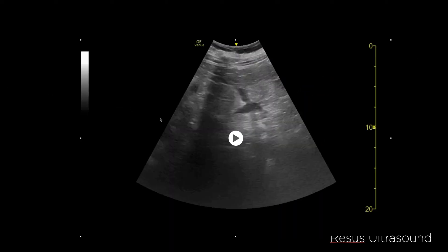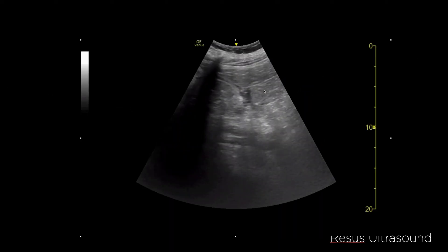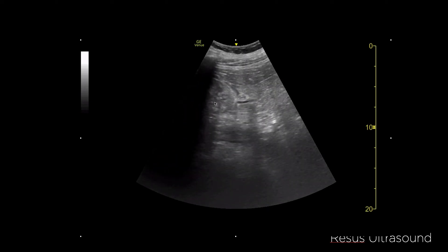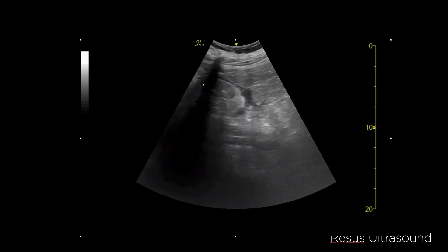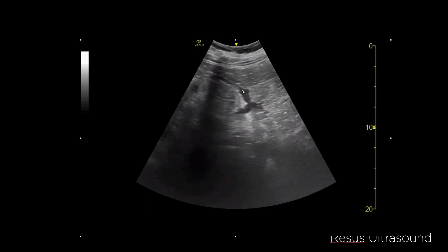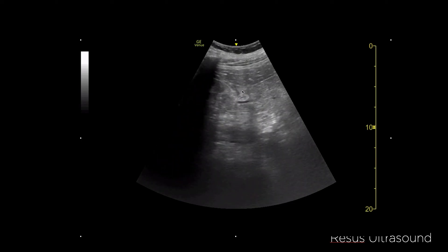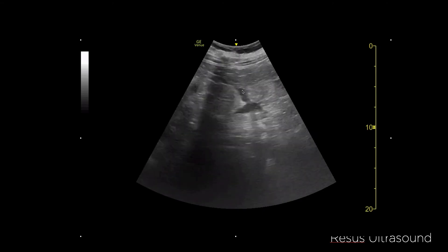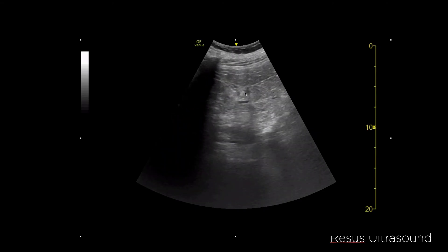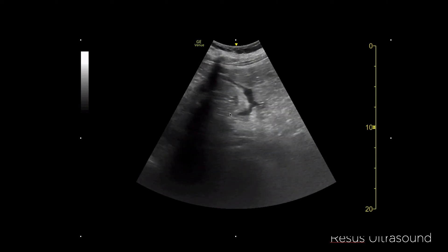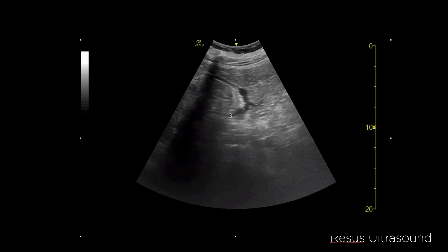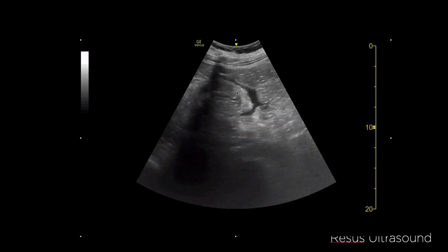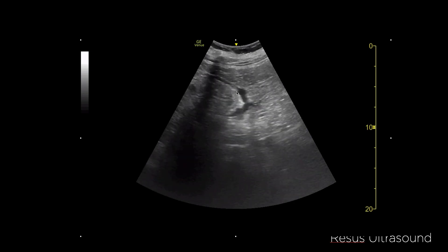This patient also has a FAST positive finding. Here is the kidney, and in the black area around the kidney you can see the FAST positive — free fluid — which is significant. Normally, only about twenty percent of Triple-A patients have a FAST positive, so be careful: if you suspect Triple-A and the FAST is negative, it doesn't rule it out.